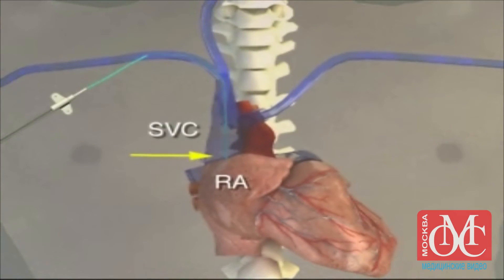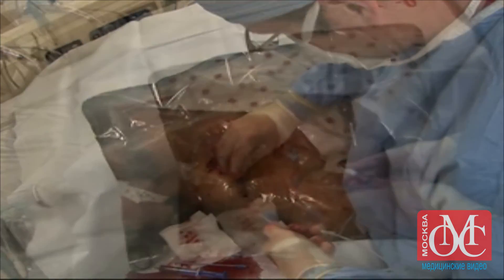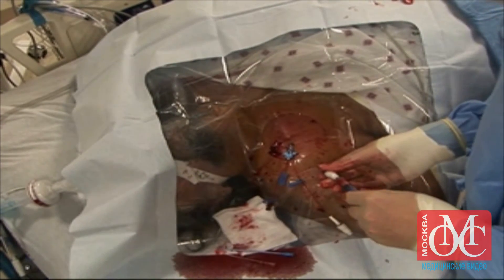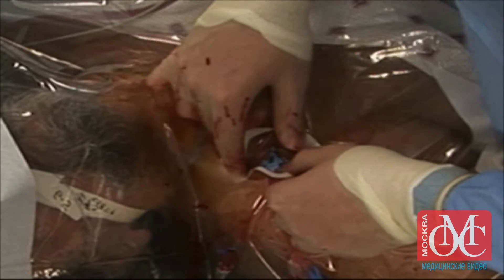Insert the catheter to a depth that places the tip at the junction of the superior vena cava and the right atrium. Remove the guide wire and check for blood return in all ports. Flush all ports, place caps on the hubs, and secure the line in place. Apply a sterile dressing before removing the drape.